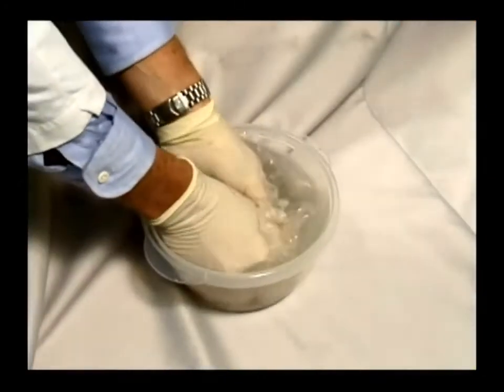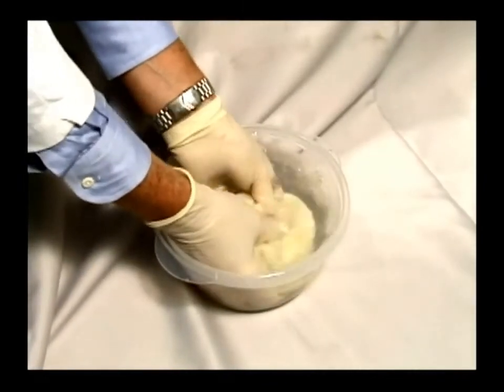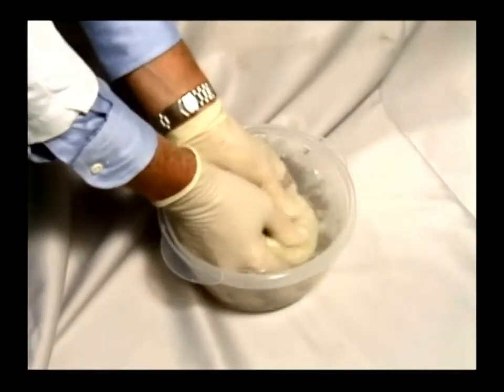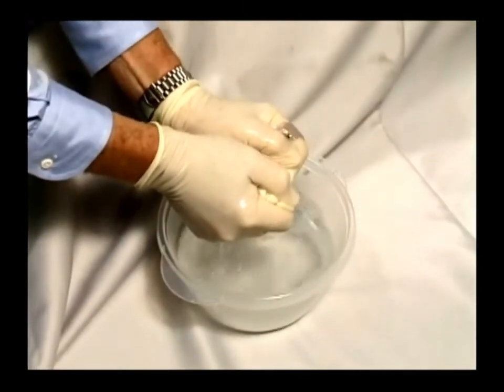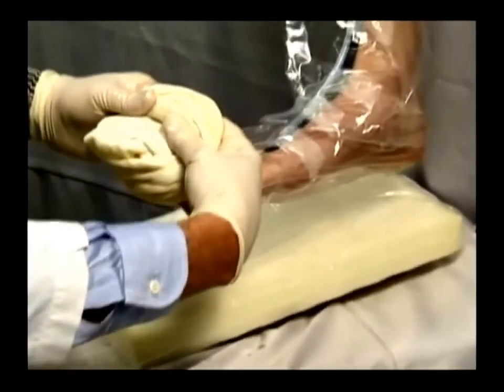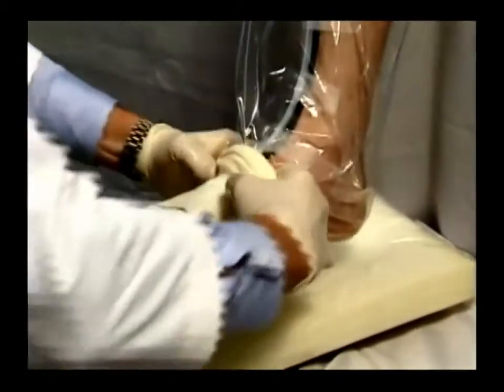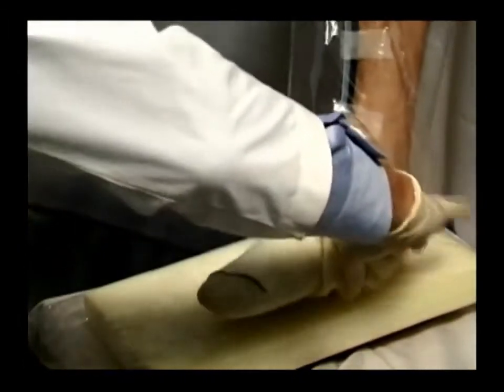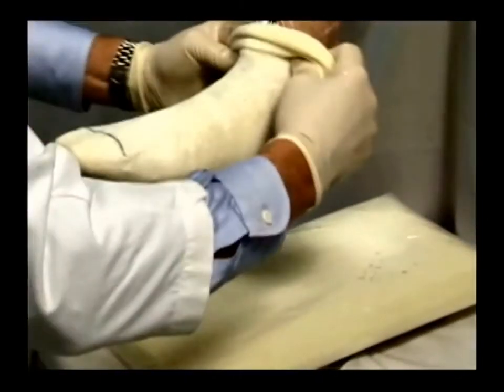When the sock is fully gathered, dip it in room temperature water and while submerged for 5 to 10 seconds, gently squeeze the sock several times to activate the resin. Remove the sock from the water and gently squeeze out the excess water so it is not dripping wet. Do not squeeze too hard as water is necessary to accelerate the curing process. With the foot still positioned 90 degrees to the leg and the sock gently stretched open, carefully slip it over the toes and over the ends of the tube and strip. Be careful the sock doesn't catch the ends of these items and dislodge them.